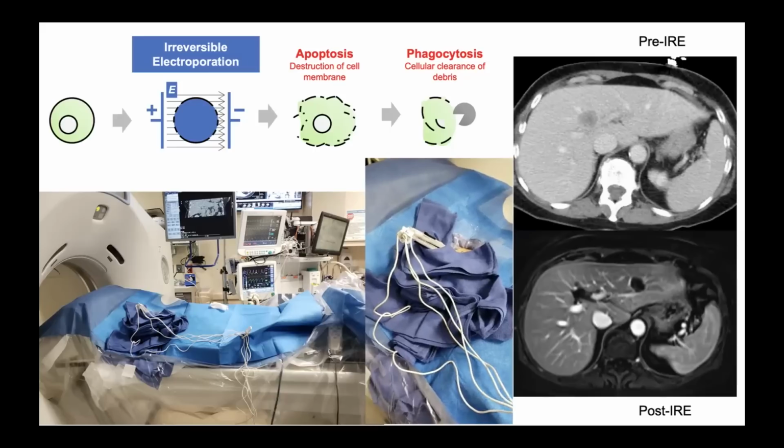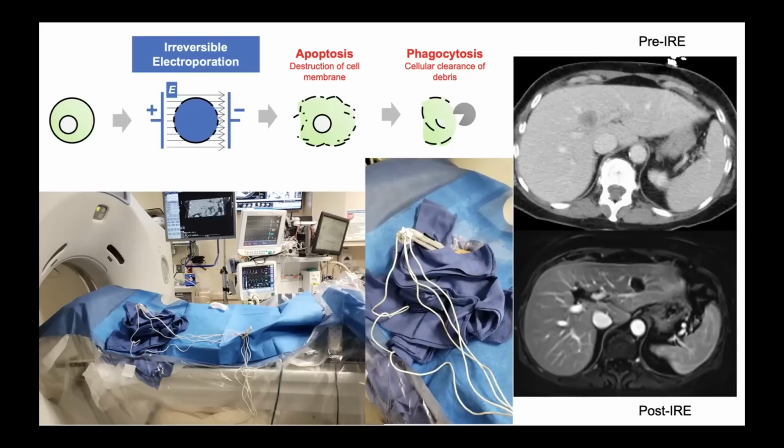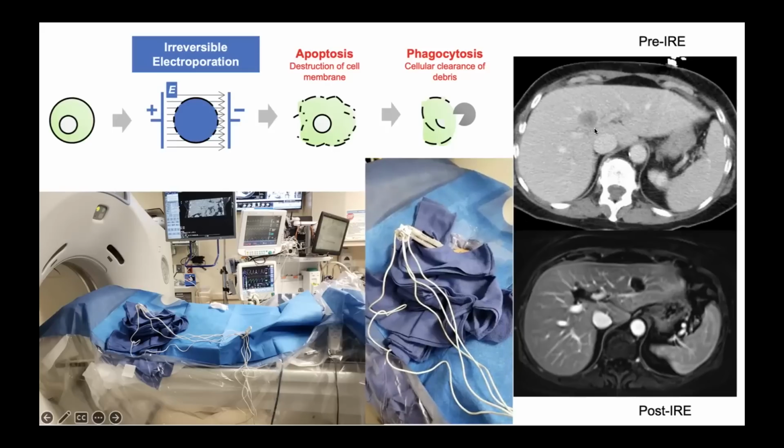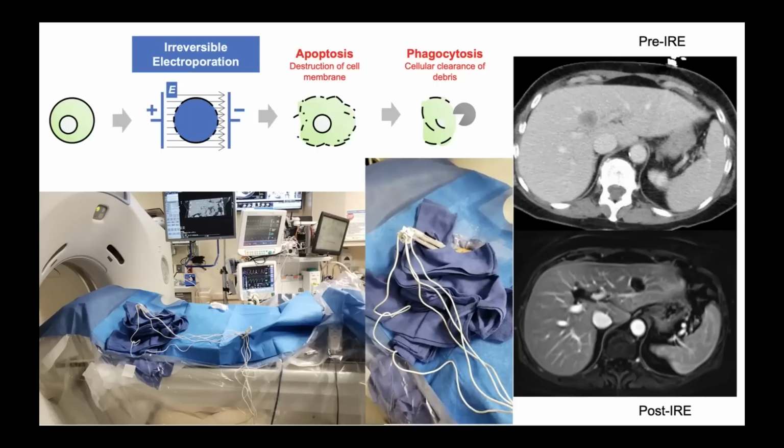This was the earlier technology, so we have to use multiple probes like this, and it has been quite effective. You can see that this tumor is smack right in the middle, which we treated, and there's no biliary duct damage, and the patient got a good treatment.